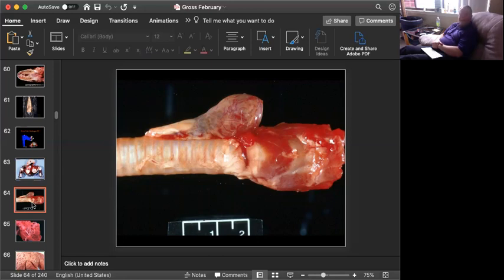Okay, time's up. I'm not sure what happened to the thyroid in this picture, but the one that's there certainly is rather large. My morphologic diagnosis would be multiple thyroid adenomas. It may be one big one, but the nodular appearance of the thyroid and the number of these I've seen, usually there are multiple large expansile nodules in there. You may have hyperplastic thyroid tissue in between, sort of getting crowded out. Some people like the term nodular adenomatous hyperplasia. I'm not a big fan of that. I'm going to come down on adenomas.